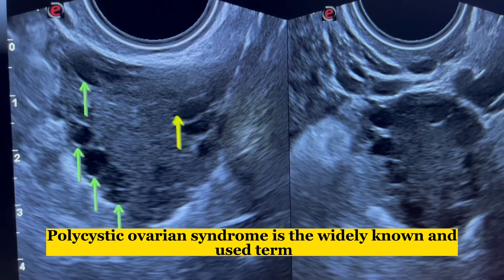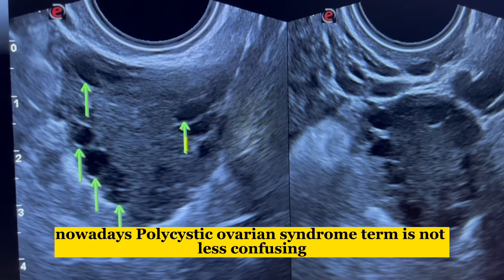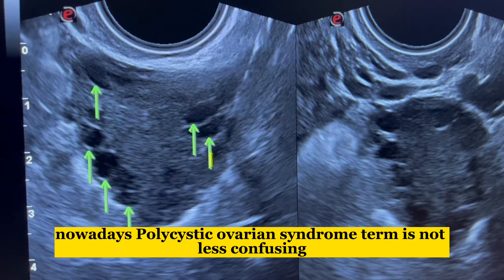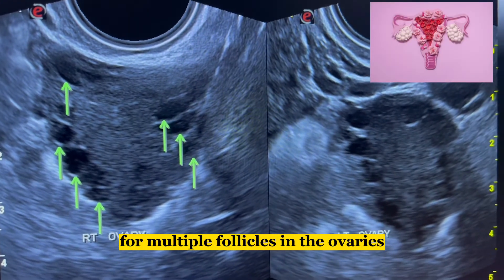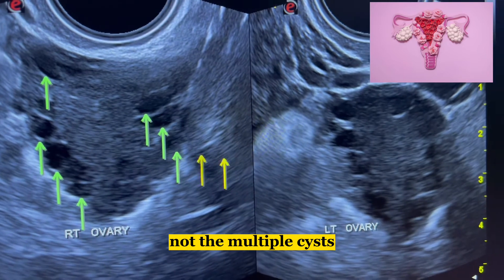PCOS is the widely known and used term nowadays. The term is not less confusing — it actually refers to multiple follicles in the ovaries, not multiple cysts.